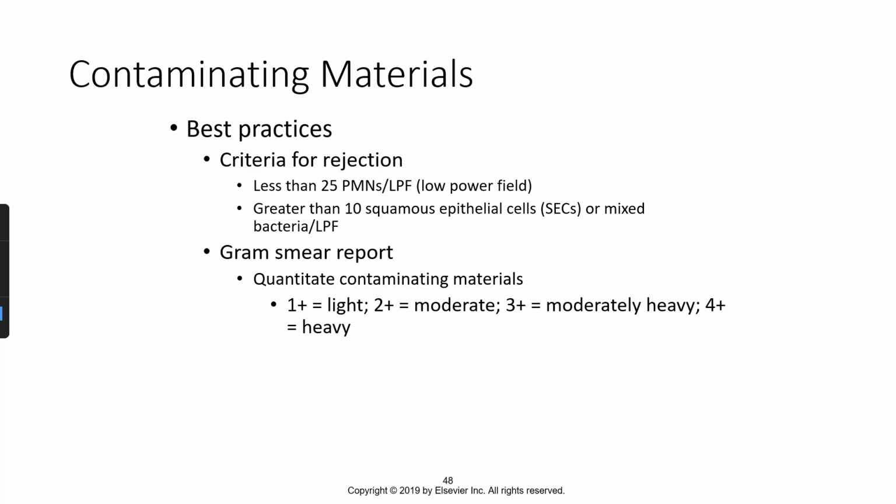We're trying to get the best culture from the best specimen and make sure that we're doing the diagnostic procedures appropriately. It's not the physician or nurse's fault either. It's just sometimes these specimens are not appropriate for culture. So it creates a little bit of tension between laboratory professionals and the nurses.